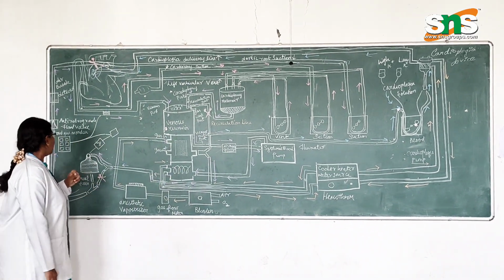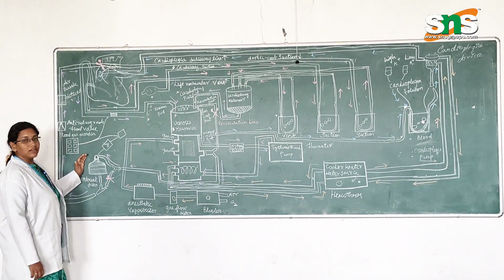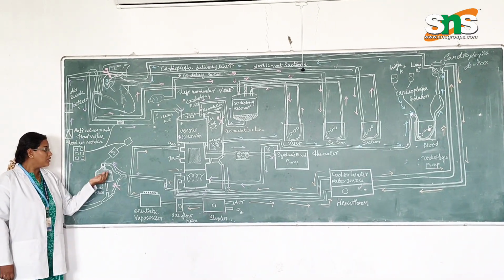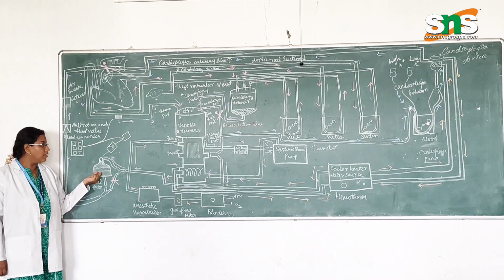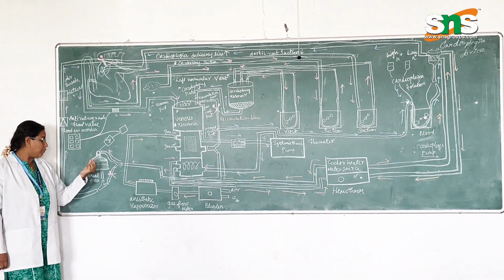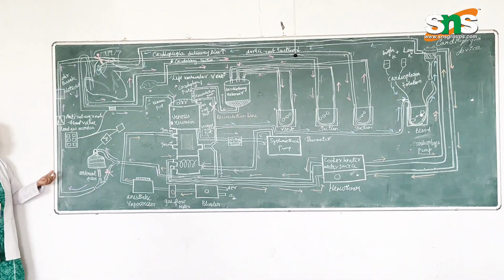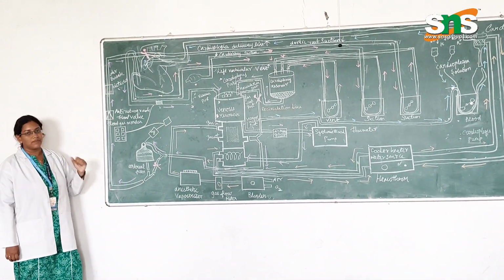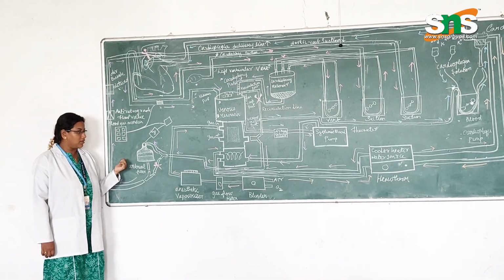Another important factor is arterial filter failure. Sometimes a clot or debris can get stuck inside the arterial filter and cause membrane damage in the arterial filter. Once this happens, there is a chance of air embolism, or air or blood traveling to the patient. It is a very crucial accident.